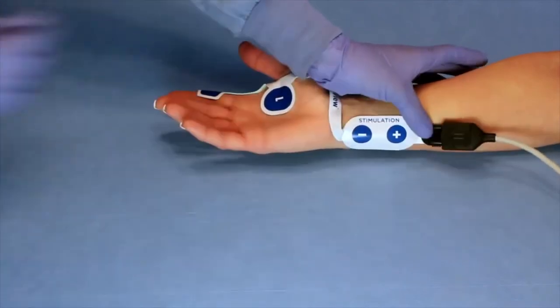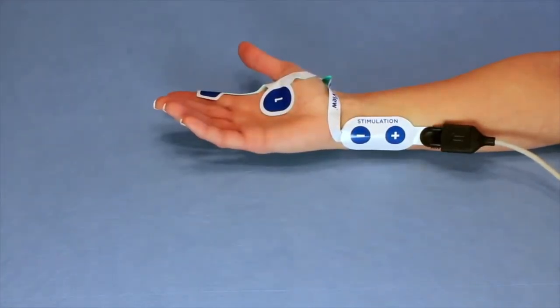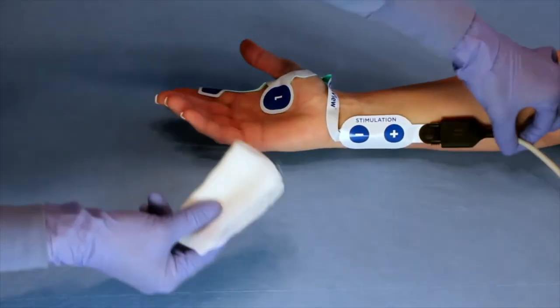If desired, a gauze can be placed under the cable to minimize skin compression.